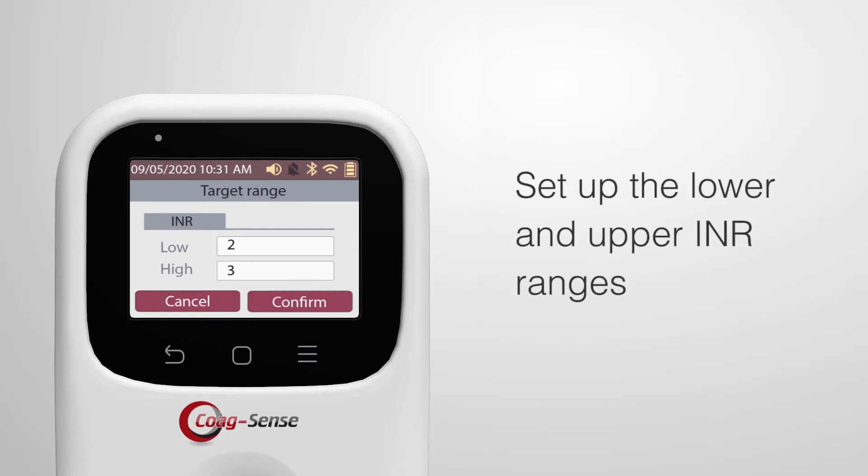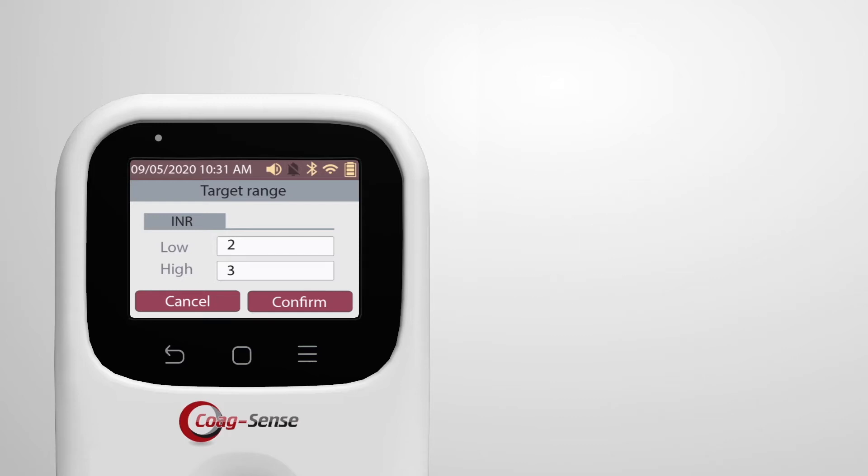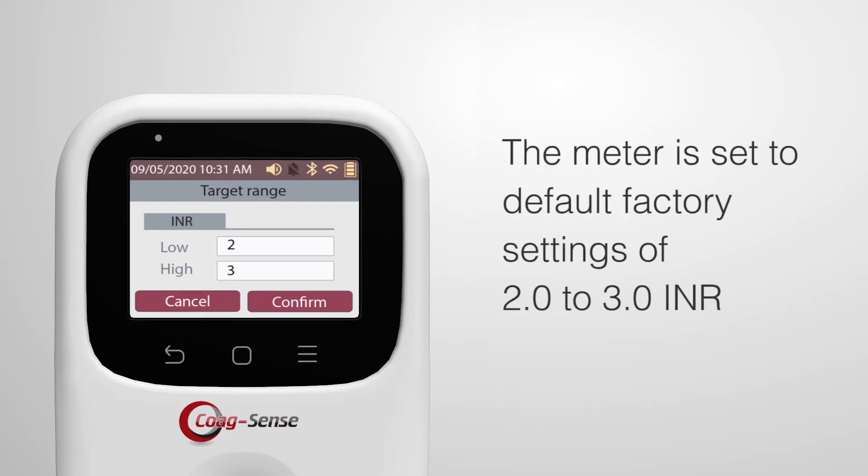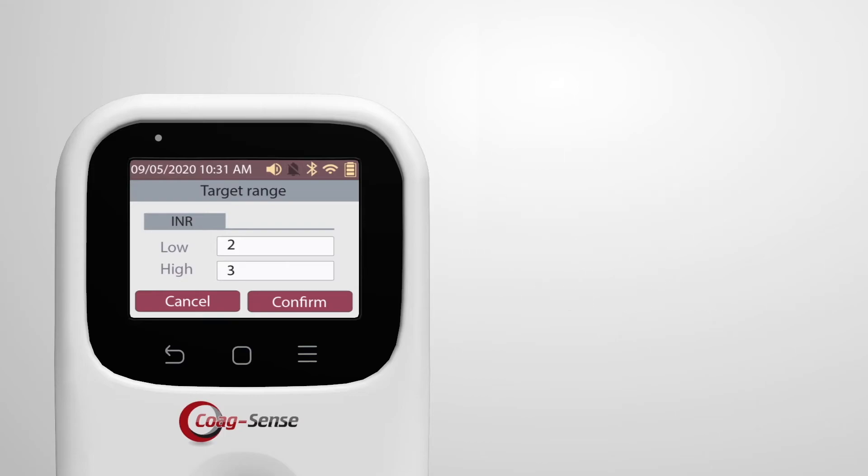Set up the lower and upper INR ranges of your target range accordingly. The meter is sent to default factory settings of 2.0 to 3.0 INR, which should be changed to individual ranges.